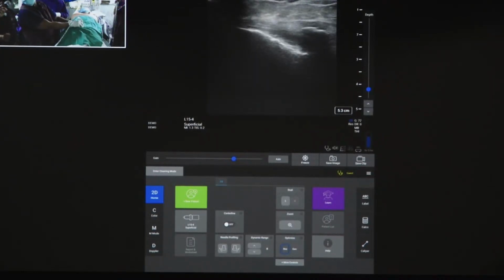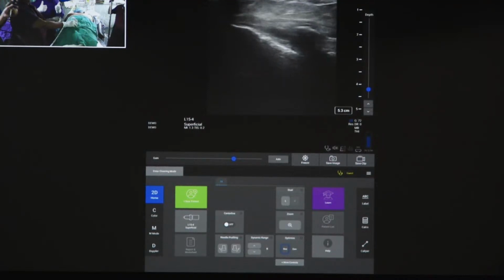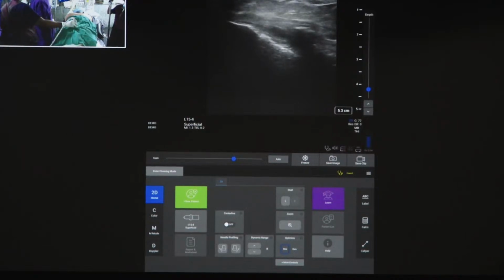That is the epidural space. So once we mark it, then we can give a local here and confirm with the CM. You can take it.